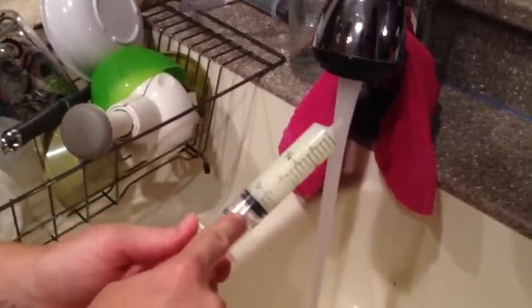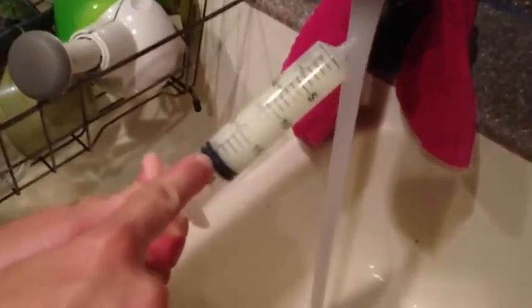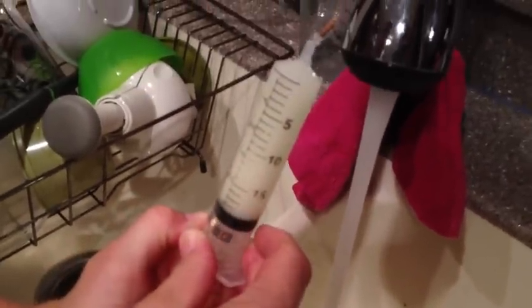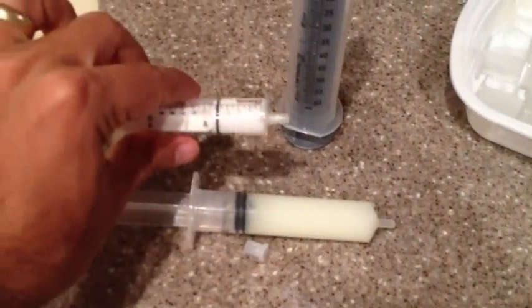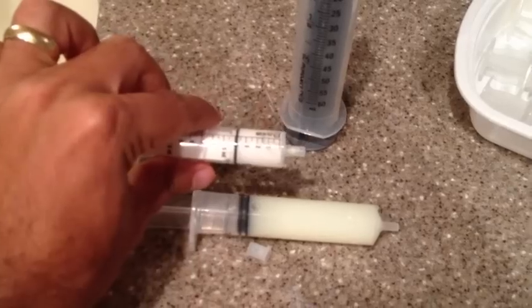For the morning, we want to fill it up to around 20 cc's. Keep shaking it up, get all the air out of it, and it'll be ready to go. For the morning, that's all you're going to have — just this one vial. For the night, you're also going to have the white liquid vial.